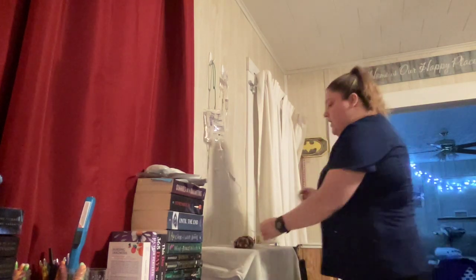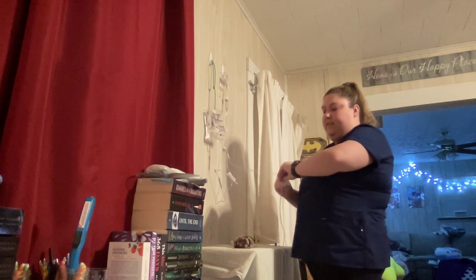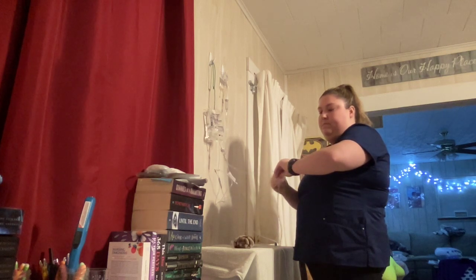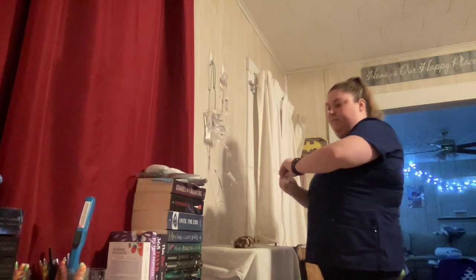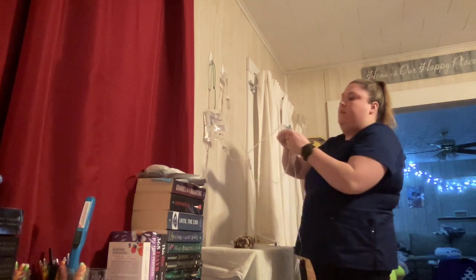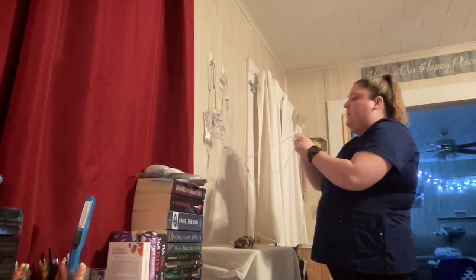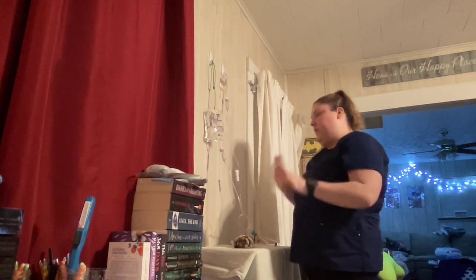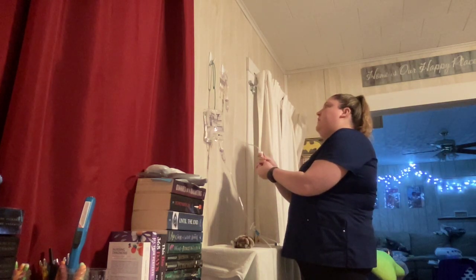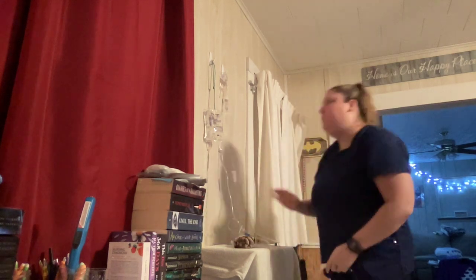I am going to take another alcohol swab. I'm going to clean this Y port here for 15 seconds. Alrighty. Careful to keep that clean, not touch anything. I'm going to connect the two. All right, as of right now, both of my tubings are clamped. I'm going to completely unclamp the cefazolin, and I'm going to set the drip rate at 25 drips per minute using my primary tubing clamp.